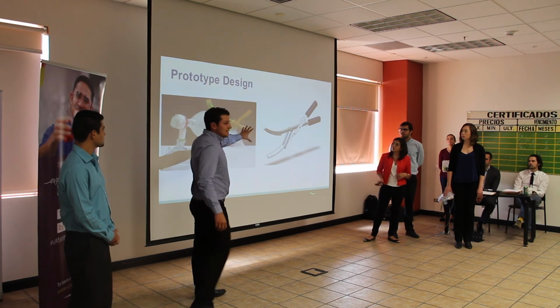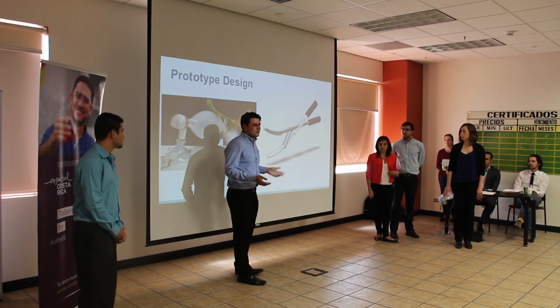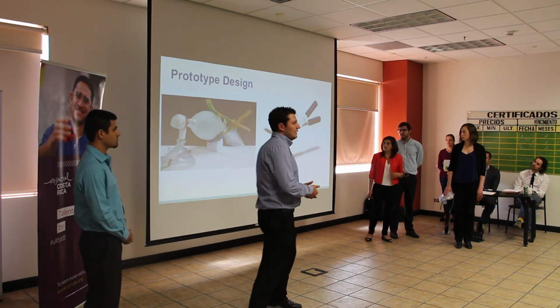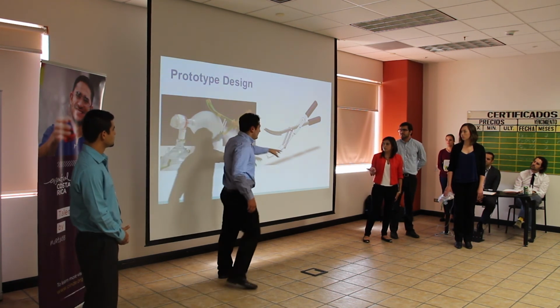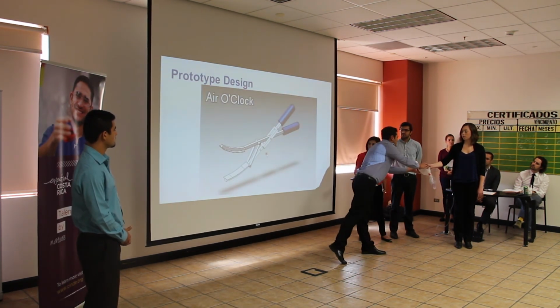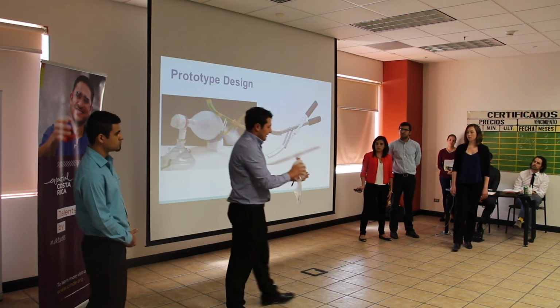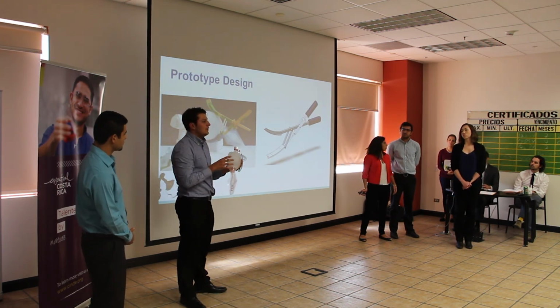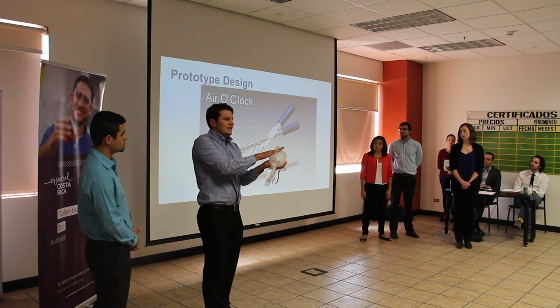Also, we made a CAD design, that is right here, and for you to understand the product better, you will have handles to make sure that the person is going to handle it very well. Also, they have this shape because we discovered that if you push it this way, it's going to do nothing. So the bottom part is going to hold it and not allow this to displace. And also, this other part is going to push like this.